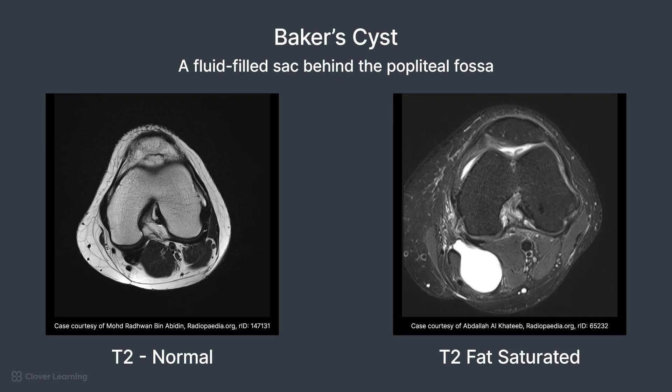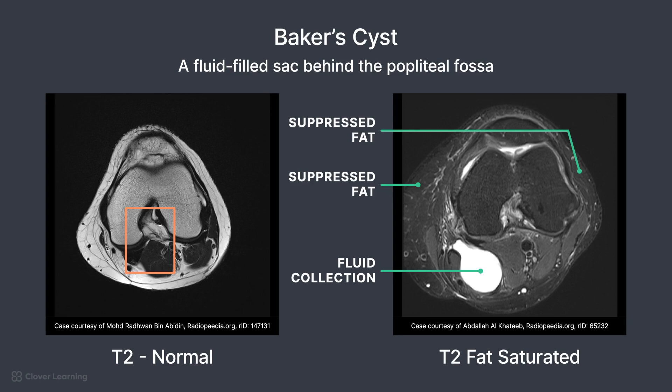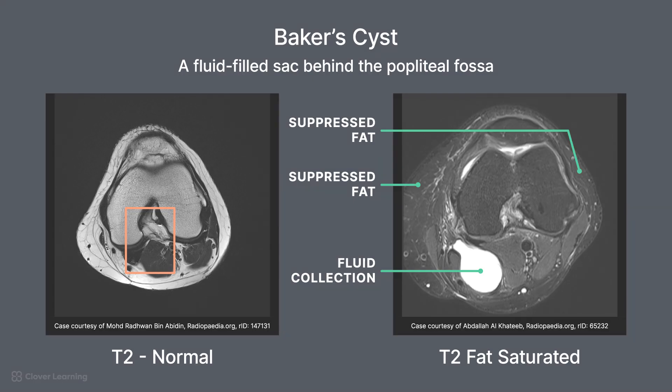On the first T2-weighted image, you can see a normal popliteal fossa with no cystic structure. On the second image, T2 fat-saturated, you can see a Baker cyst with a high-signal fluid collection behind the popliteal fossa and uniform suppression of fat tissue to better demonstrate the bright cyst. This has been an overview of common pathologies of the knee seen in an MRI.